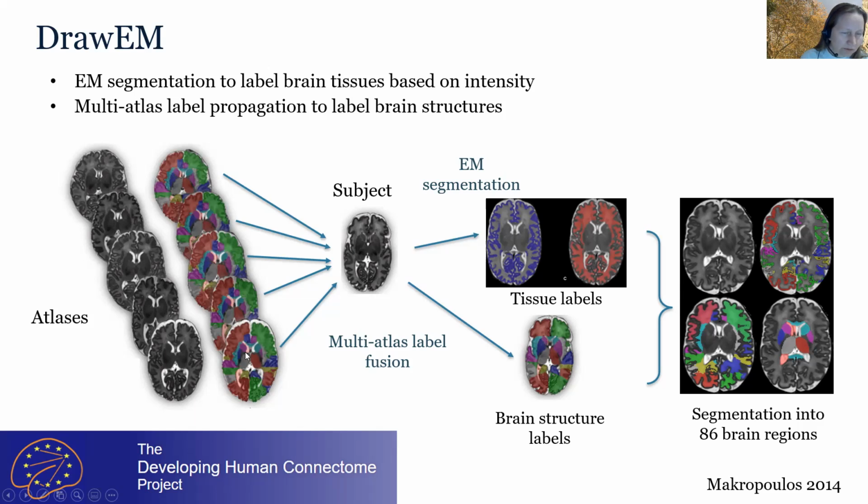We don't have all the labels in the atlases, but we only use atlases for the brain structures that have some kind of anatomical meaning, but are not necessarily possible to separate based on intensity. For example, different cortical lobes or different subcortical structures that might have overlapping intensities. This kind of protocol is decided by the clinician or a neuroscientist to define anatomically meaningful regions.